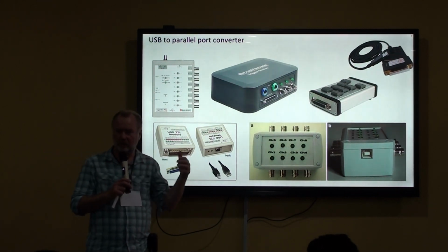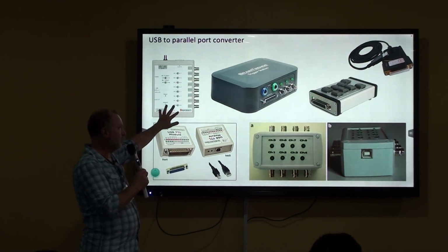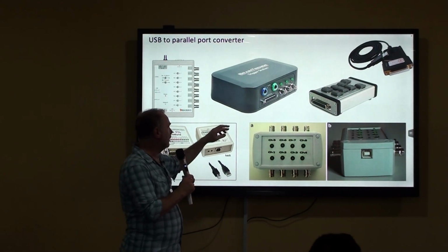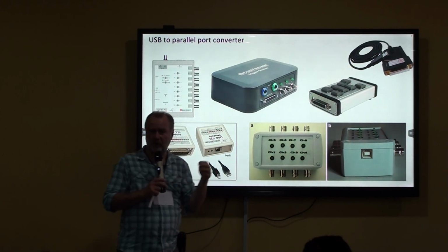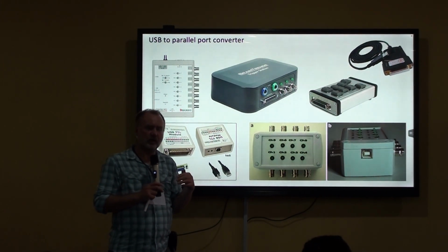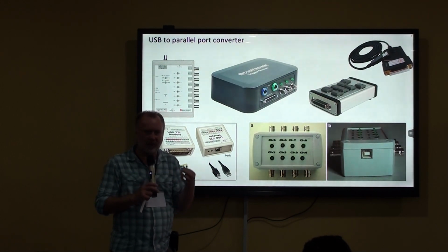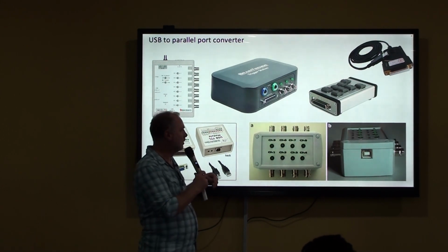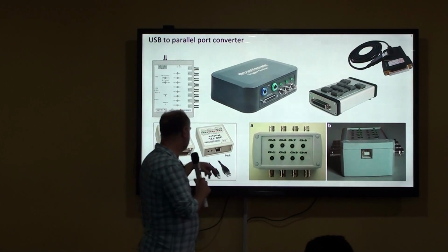So different companies have different ways of triggering. This is the trigger box that comes with the Brain product system. This is a trigger box that you can buy separately, and I think it is a relatively fancy one. It also has audio triggers. So you can directly connect a microphone, which means that the trigger is going to be sent when the subject starts speaking. So that's convenient, because then you don't have to record the audio, because you just record the onset of the audio. This is a simple one that I showed, and these are very similar ones.